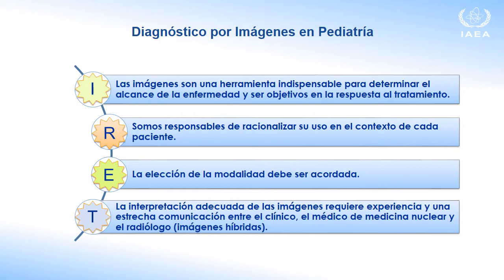Therefore, the choice of the modality must be agreed. A proper interpretation of the images requires experience and close communication between the clinician, the nuclear medicine physician, and the radiologist in case of hybrid imaging.